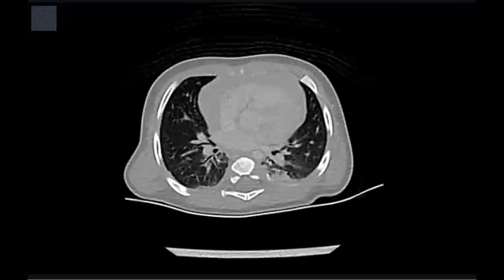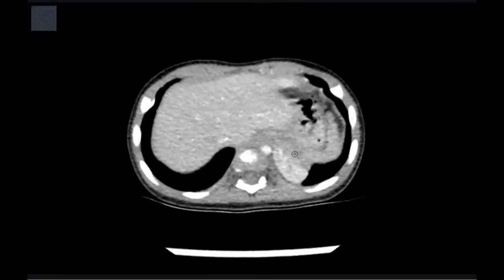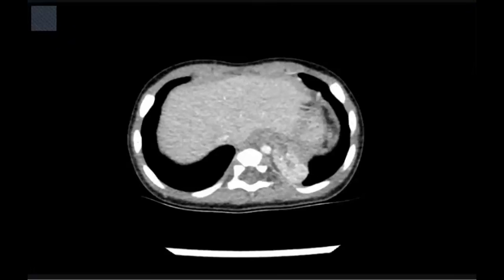Then we have to go for the CT with contrast to see the arterial supply and the venous drainage. If the supply is systemic, arterial and venous, so it is extralobar. If the venous drainage through the pulmonary vessels, so it is intralobar. Extralobar is associated with multiple anomalies, as you called CPAM, congenital heart disease, diaphragmatic hernia, may be also associated with scimitar syndrome.